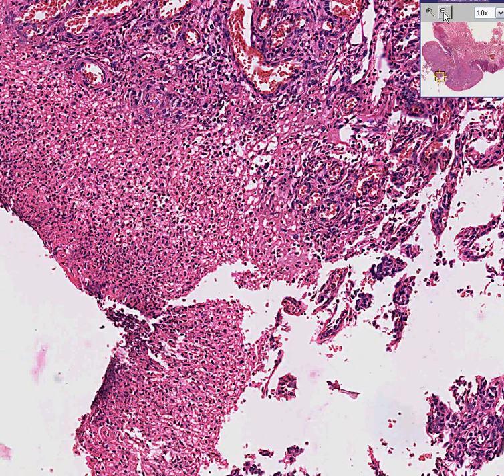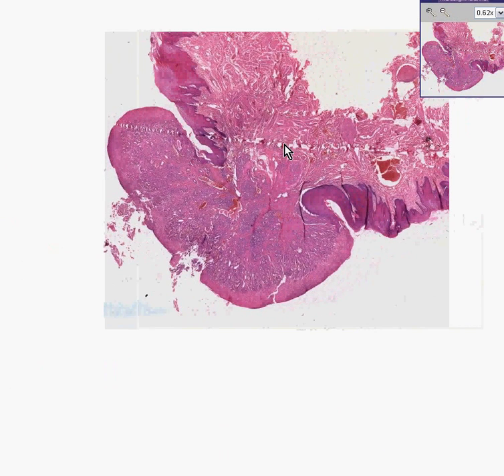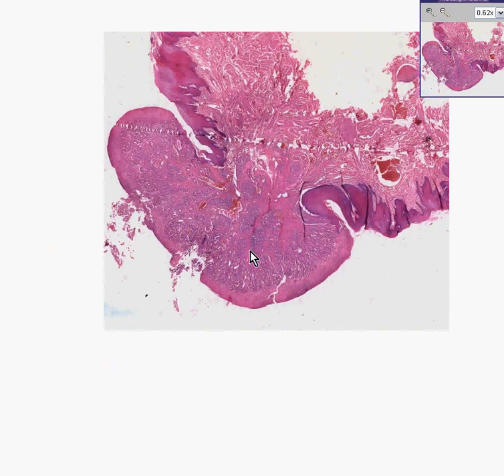Pyogenic granuloma of a non-keratinized stratified squamous structure — in other words, the mouth, the oral mucosa — having the exact same appearance as granulation tissue, or very similar to a benign growth of blood vessels called a hemangioma. Thank you very much.